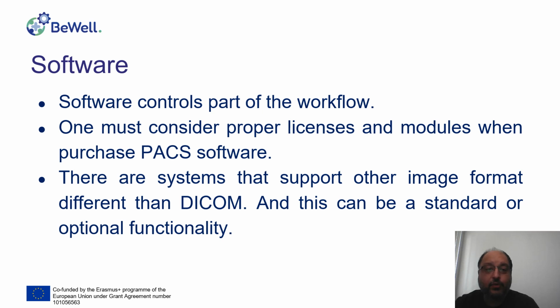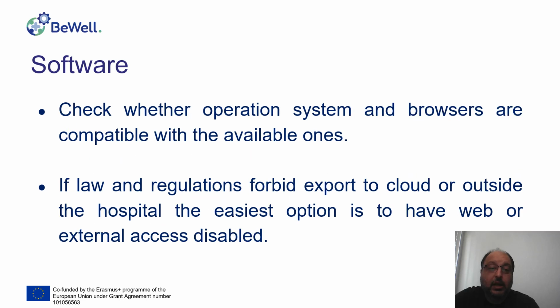These systems, for example, may support other image formats different than DICOM, but if you need such, you have to look if it is included in the standard version, or it is an optional version, or it is not available at all. The picture archiving and communication system runs on a specific operating system, and you have to ensure your operating system is compatible with the software, or otherwise you will finish with something that will not work for you.